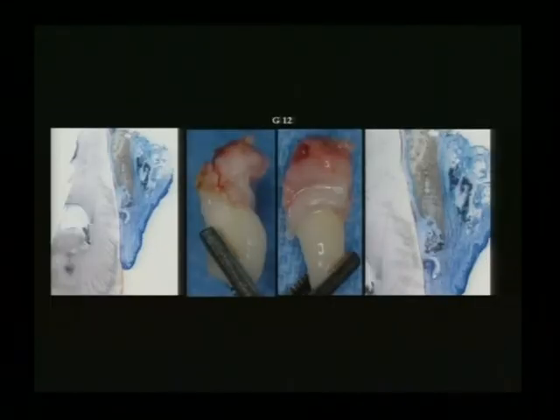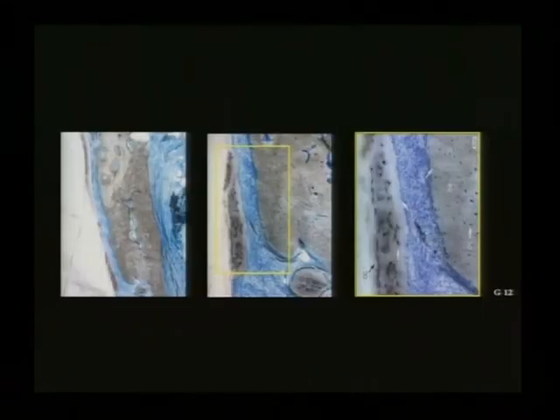You can clearly see the old bone up here. You see the new bone coming down the root. This is some residual TCP. We found this to be a problem with a number of the patients. It seems the TCP was not all resorbing. It may have been keeping our graft from being quite so robust. But clearly, this is the old bone. You see the new bone.